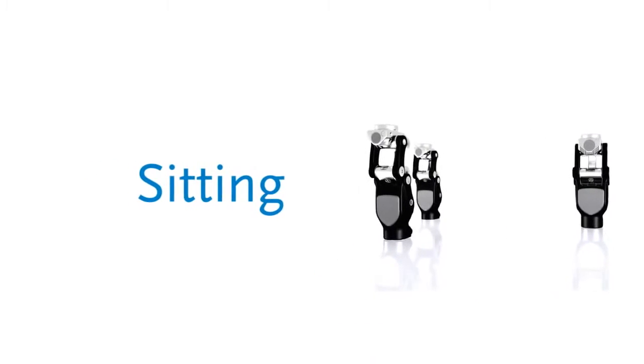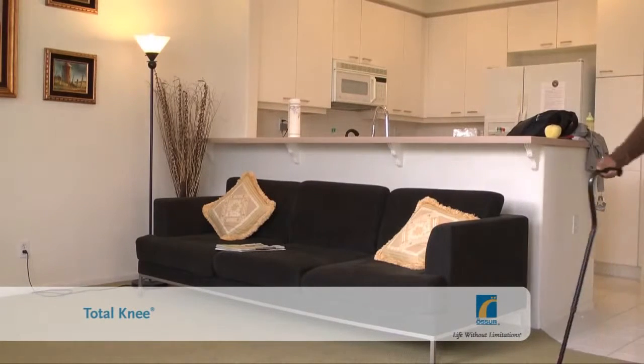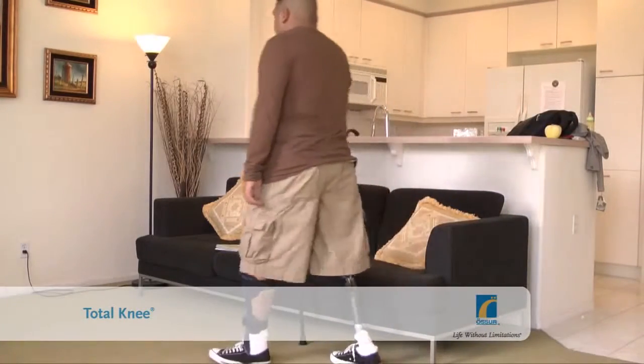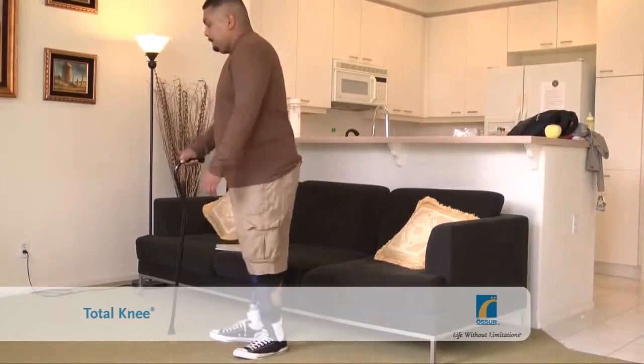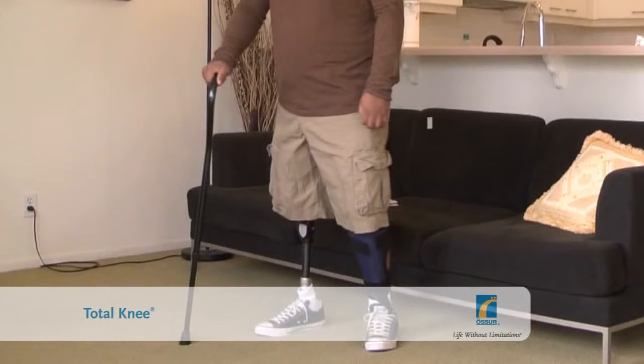Sitting. The total knee has a wide range of motion, which means sitting down comes naturally to its users. When you want to sit down, it helps if you position your prosthetic foot slightly behind the other. Shift your weight forward at the hips and then flex your thighs. The locking mechanism in the total knee will then release and allow you to collapse the knee.